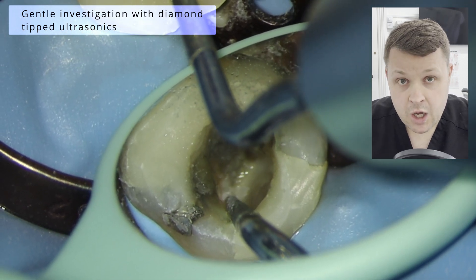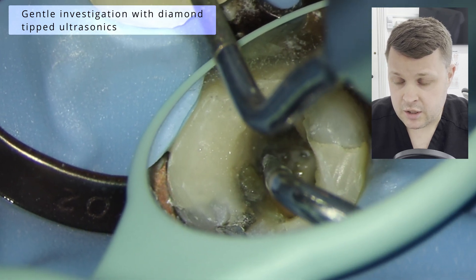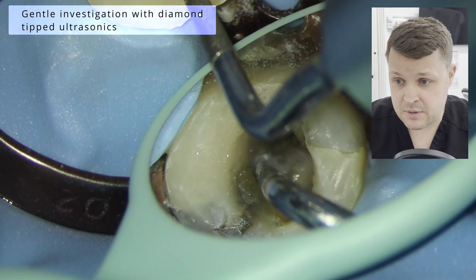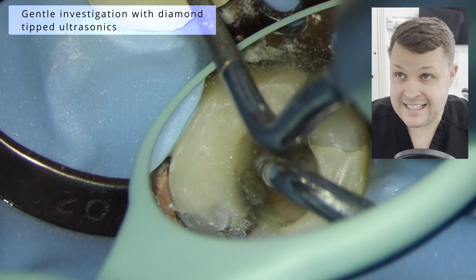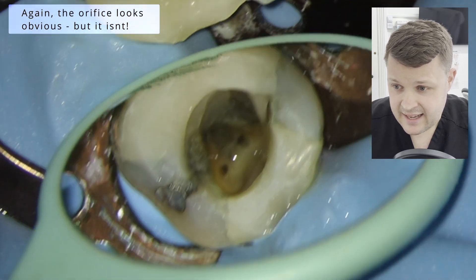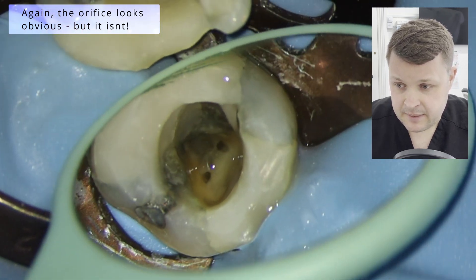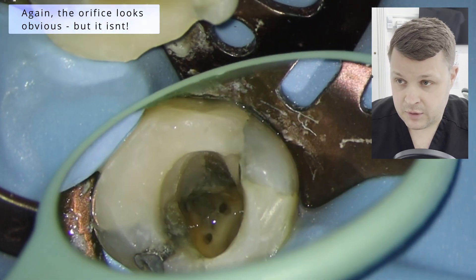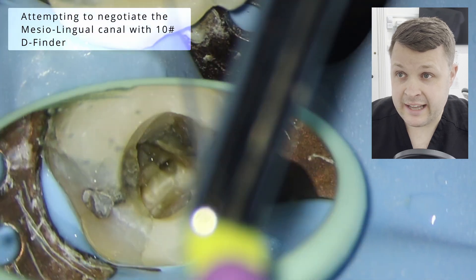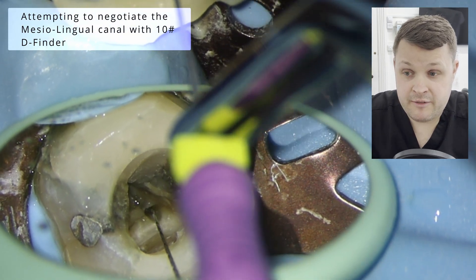What I'm going to do here is use some low-energy ultrasonic. These are tips called endosuccess tips, and they're just used on a dedicated endodontic unit. Again, it looks like it's obvious here, but looking back on this, maybe it was the endodontic tips that were causing this sort of faux kind of access.